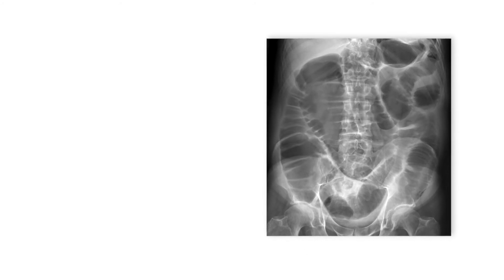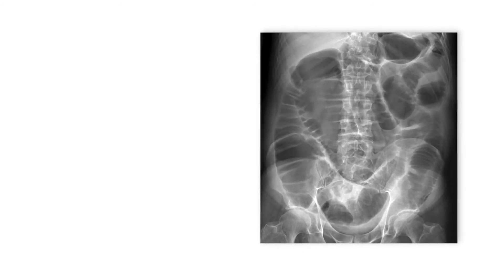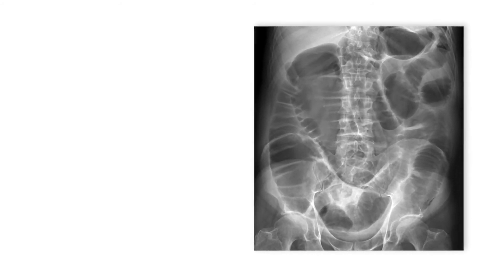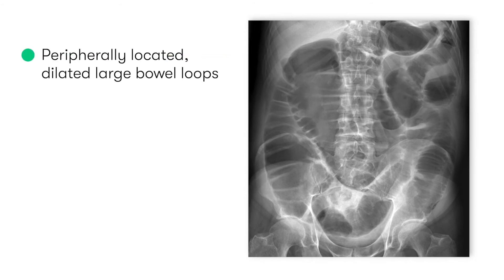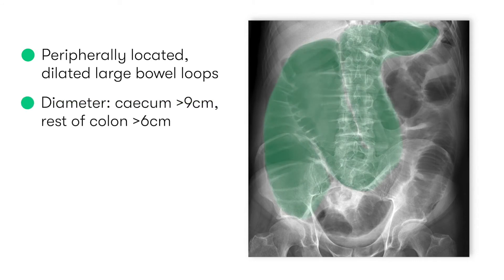Looking more closely, in abdominal X-rays of large bowel obstruction the features we'd normally expect to see are peripherally located dilated large bowel loops, with a diameter of more than nine centimetres for the caecum and more than six centimetres for the other parts of the large bowel.